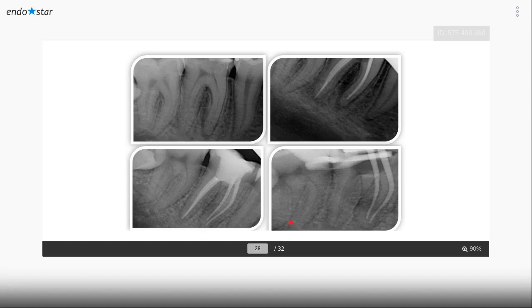When I used the 25 taper 6, it was very easy, here in the second picture, to reach up till this point only. But later on, I could not go any further. And the apex locator kept telling me I still need around 2 millimeters in both canals. Here you can see it's only one canal, but there are two canals, as we see in this picture.